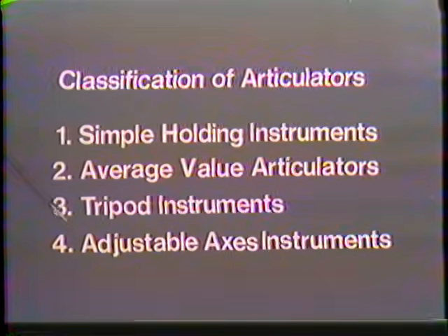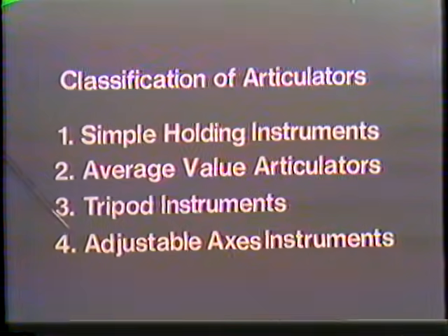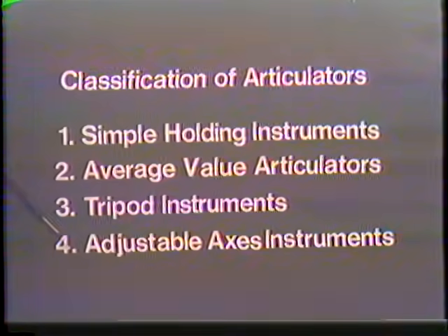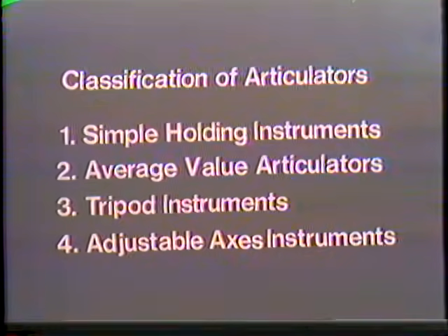And we have the adjustable axes instruments, which may be semi-adjustable, those instruments which only accept a protrusive record, or the more adjustable instruments which will accept also lateral positional records, also pantographic recordings, or the stereographic type where we actually form the condylar elements on the instrument. And lastly, of course, a simple holding instrument can also be used, as we showed, with the occlusal path technique or the generated path procedure.